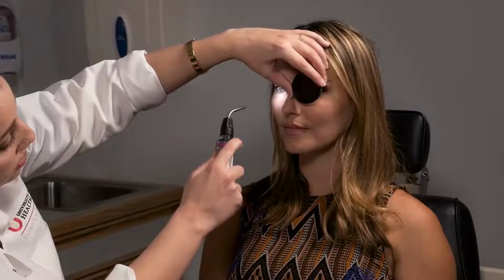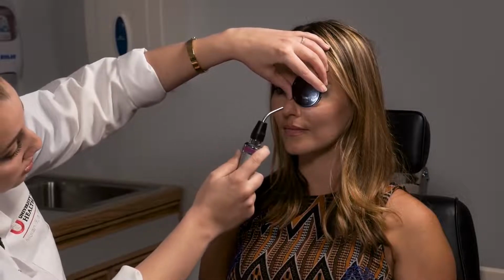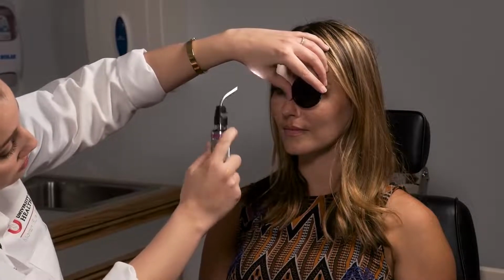So for this instance, I'm going to hold the neutral density filter over the left eye. The left eye will perceive less light, and the pupil should dilate on the swinging light test. So if you'll just look straight ahead again for me. This is the swinging light test. Instead of constricting on the left side, the pupil dilates slightly.